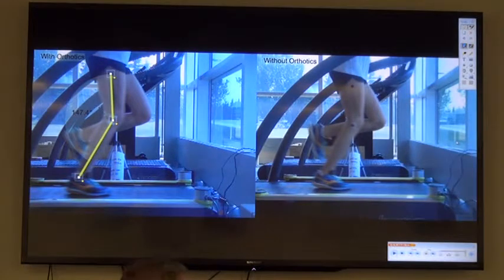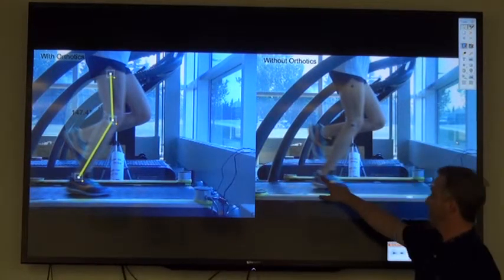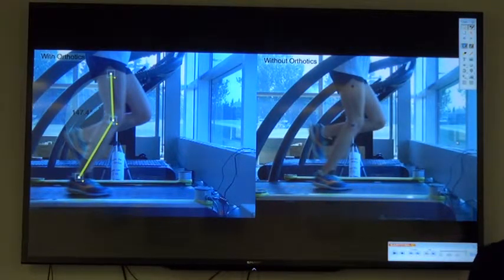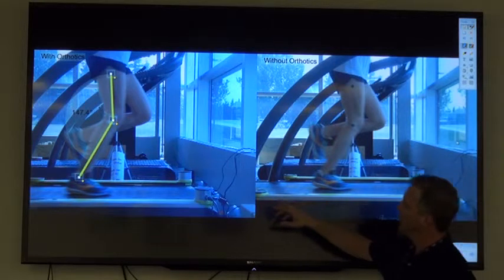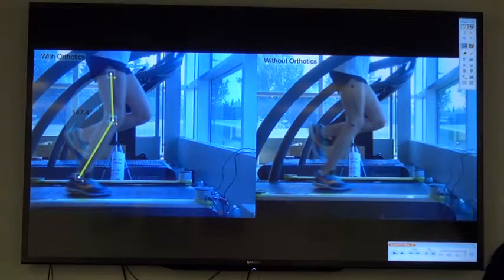This is the first time I used these stickers, but you notice right away in this situation that the marker's gone. It's flopping off here. She started sweating, and the adhesive wasn't too good. So then I started putting, in that situation, you're going to notice some tape on top of the markers as well, to just hold them down.